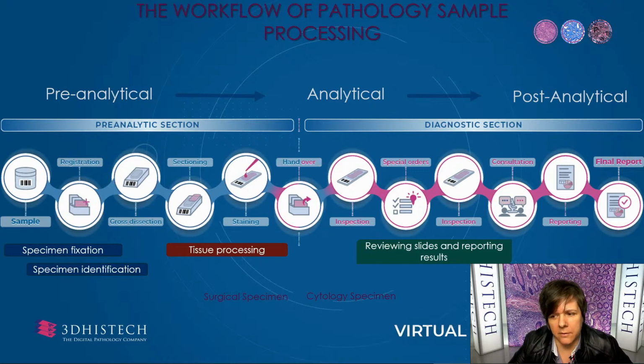Identifying those errors and their root causes in the clinical setting can be perplexing. The errors are often partitioned into processing, technical, and documentation categories. Errors in pathology are more traditionally subdivided into pre-analytical, analytical, and post-analytical phases as the laboratory's whole workflow.